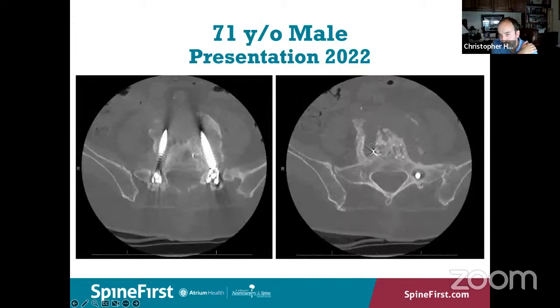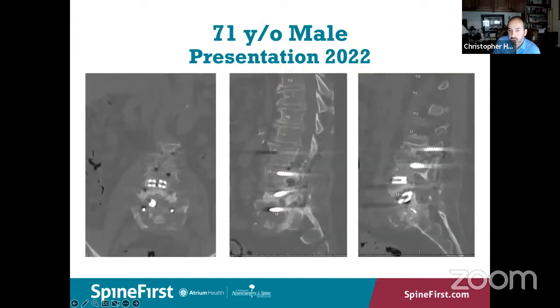Here are some more images from that CT. Again, you see that most of the ventral portion of the L5 and L4 vertebral bodies has disappeared, as well as this defect extending down into the L5-S1 interspace, where there does still appear to be solid bone within the PEEK interbody cages, but you can see the haloing around the screws at that level. Here are some more images, again coronal and sagittal CT images, showing a severe osteolysis at the L4-L5 segment.